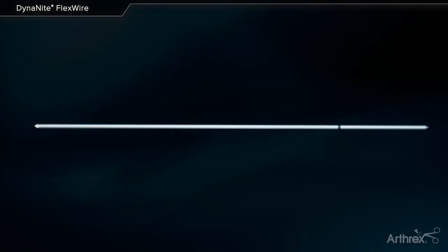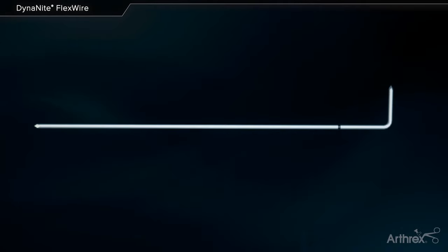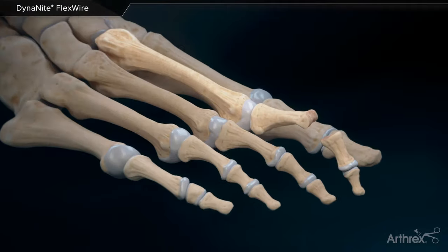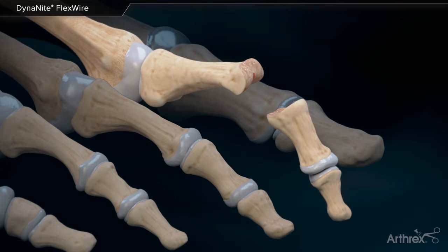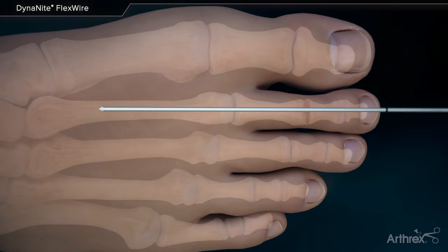of nitinol. The remaining one-third portion has malleable properties to allow the wire to be bent, cut, and capped in standard K-wire fashion. After the PIP joint is prepped for hammertoe correction, the superelastic end of the wire is inserted into the central portion of the proximal phalanx and then removed to pre-drill. The wire is then placed on top of the foot with the laser line just at the tip of the toe.